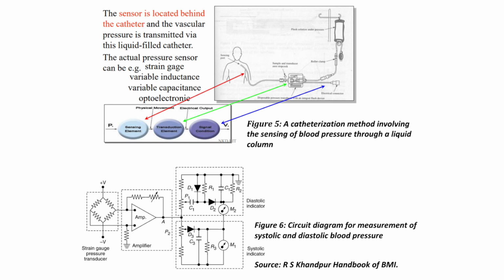The input stage is a differential circuit which amplifies pressure change which is sensed in the patient connected circuit. The gain of the amplifier can be adjusted depending upon the sensitivity of the transducer. After RF filtering, the signal is transformer coupled to a synchronized demodulator for removing the carrier frequency from the pressure signal. For the measurement of systolic pressure, a conventional peak reading type meter is used.